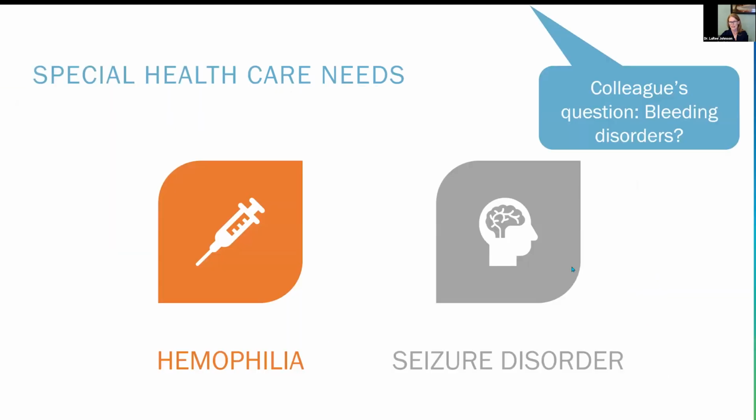Now, the faster acting using intraosseous doesn't matter because it's all ready to go as soon as you deliver your solution. And again, I don't know how many here on the call tonight see those with special healthcare needs. We see many children with special healthcare needs. So if you have a child that has hemophilia and you are giving a nerve block, you're giving inferior alveolar, you absolutely have to, in most cases, always consult with the hematologist. You have to deliver factor, which is extremely expensive, and it's a big hassle for the family. Oftentimes, after consult for those with hemophilia, and you're telling them you're doing intraosseous, obviously not removing a tooth, but doing a restorative procedure, they're fine without factor now. So that's really nice. And we already talked about those with seizure disorder.